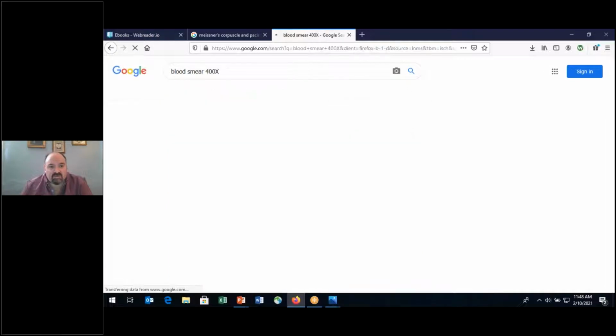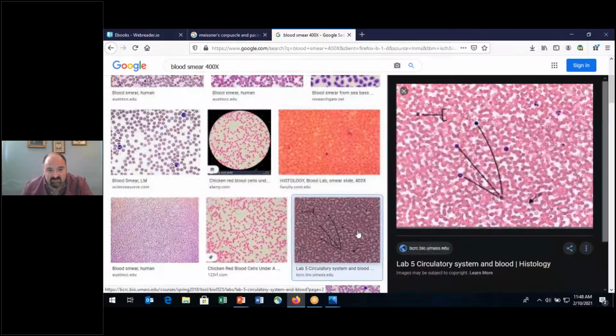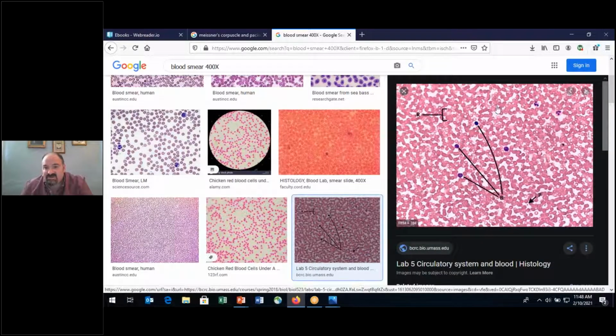Okay. So when we're looking at blood, folks, I want you to notice that this is what it kind of looked like in the lab there. What you'd see is that primarily it's erythrocytes, red blood cells. There are then interspersed, see the P here? That's a platelet right there. See, it's a little tiny cell present. And then you have these different colored pink, purple stained cells. These are specific types of white blood cells, also known as leukocytes. So this is a blood smear.